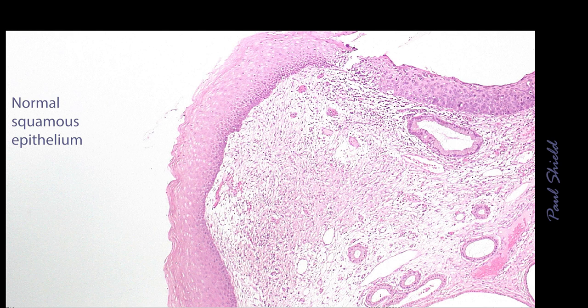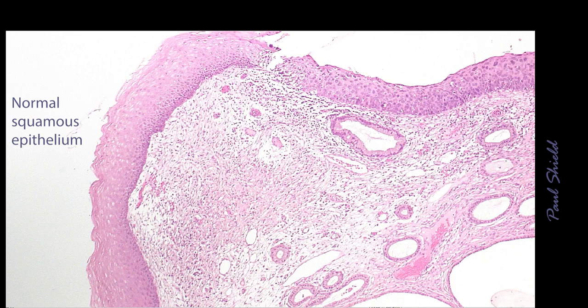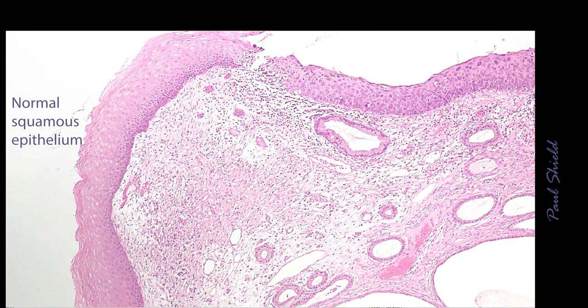So notice in that normal epithelium, it's darker along the bottom. That's because immature cells have less cytoplasm, so there's more nuclei. And there is an orderly progression to the whole thing. So the cells move up through that epithelium to the surface, they flatten out, become more squamoid looking, have a lower NC ratio, and are more keratinized.